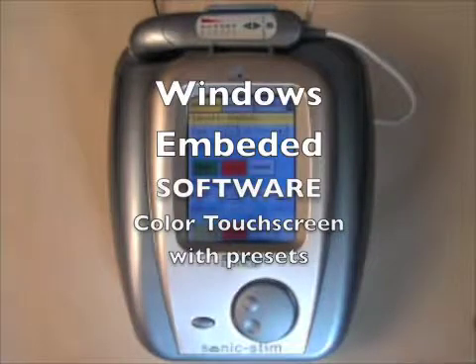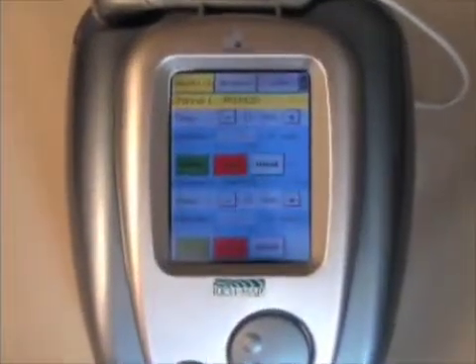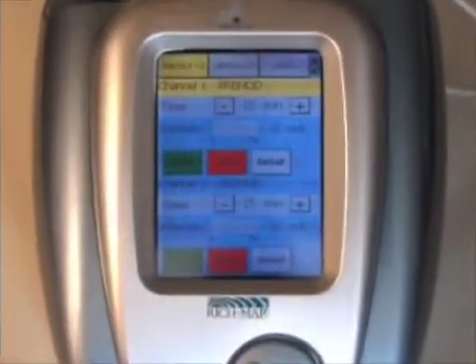The Sonic Stim is the first series of ultrasound and stim products to be operated by Windows-based software. All the units are color coded with one-touch presets for ease of operation.